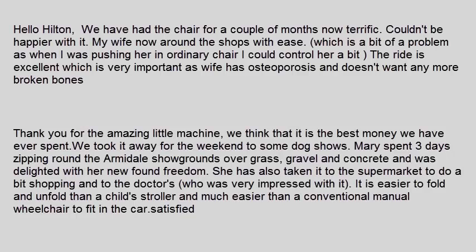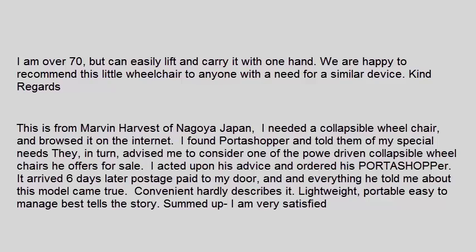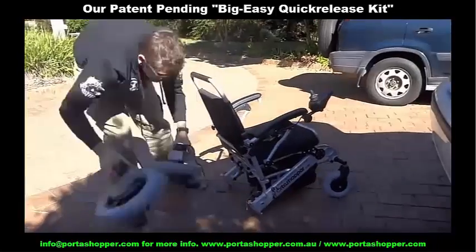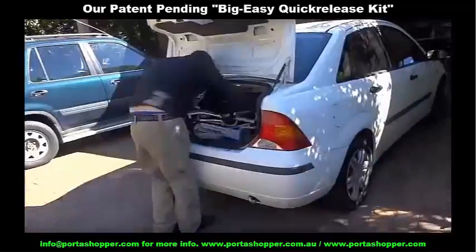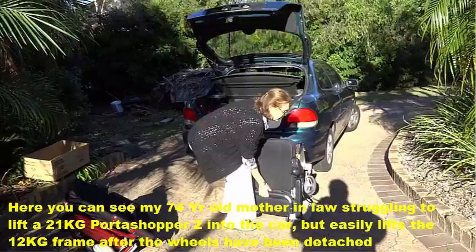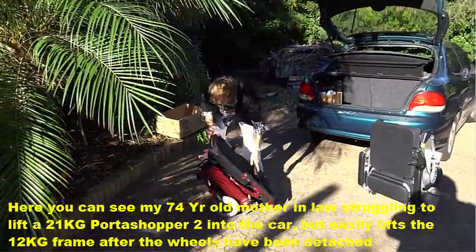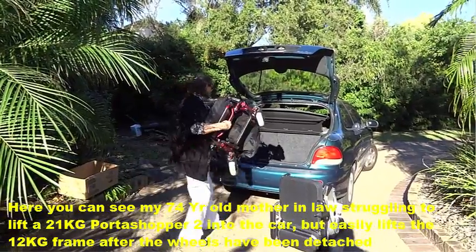During this time we have gotten dozens and dozens of testimonials from people all around the world who love the mobility and freedom that their Portashopper wheelchairs are giving them every day. All our electric wheelchair models now ship standard with our patent pending Big Easy Quick Release Kit, which allows you to quickly and easily disassemble the wheelchair into 3 easy to lift parts, the heaviest of which is the frame — approximately 12kg or 26lbs for the Portashopper 2 and Portashopper 3 models, and around 16kg or 35lbs for the Portashopper Grand and Portashopper Super Grand models.